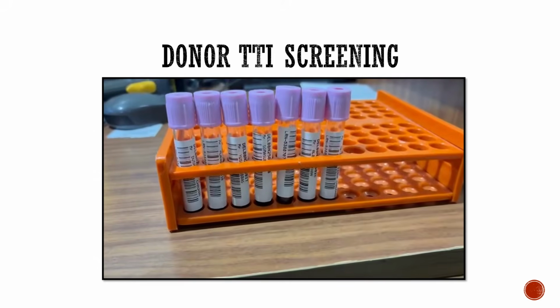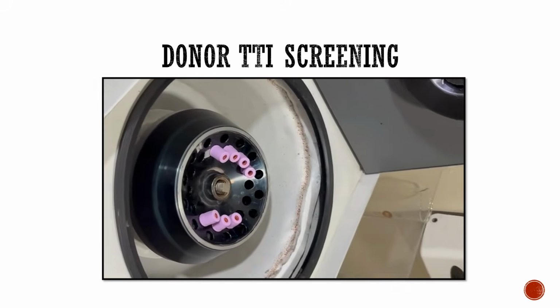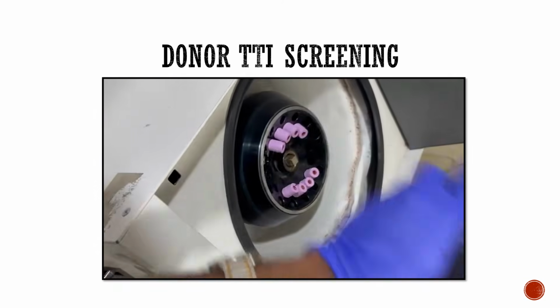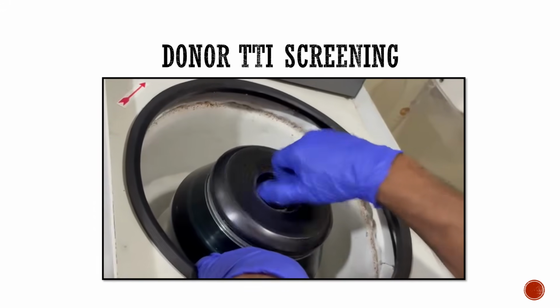Coming to the testing. Here we have taken barcode labeled donor samples. The first step is centrifugation. Place the donor samples, balance them, and centrifuge according to your standard operating procedure.